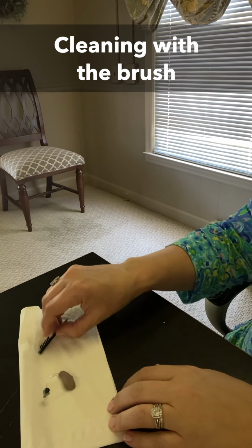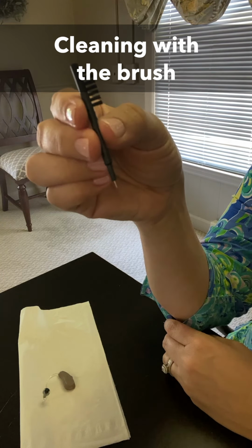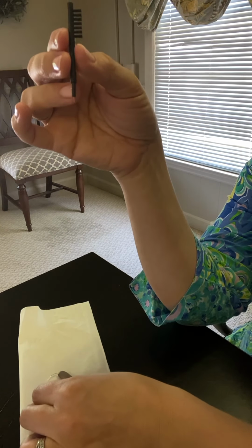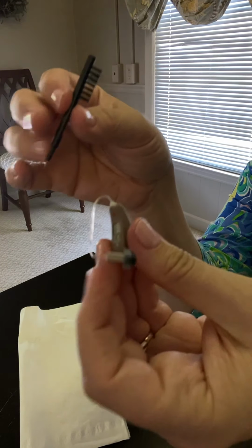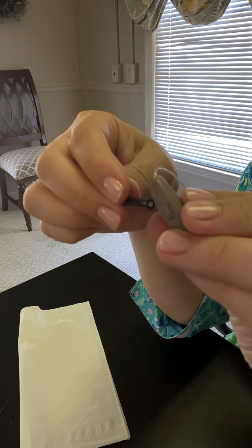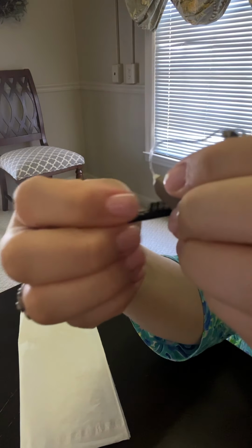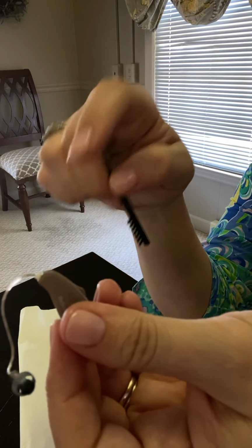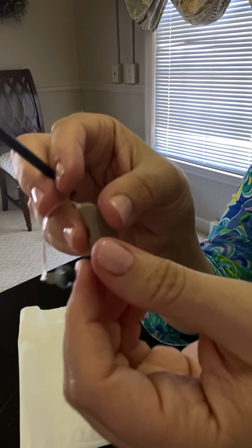To clean your device, you should have a brush, a cleaning tool in your kit. There's also a little cloth. If you prefer that, you can certainly just wipe it off. But with this little brush, every night when you take the device out of your ears, I recommend to brush off where your microphones are. And it's handy to flip it over upside down and then brush so any dirt or debris falls out instead of falling down into the device. So brush off your microphone covers.